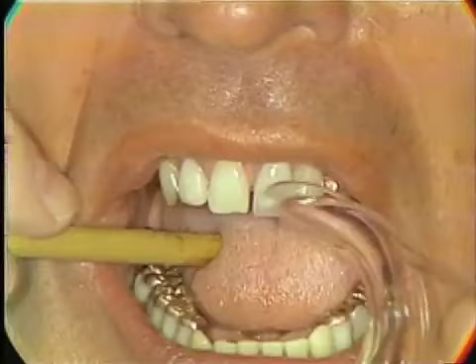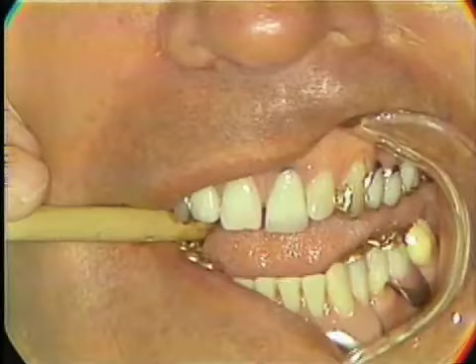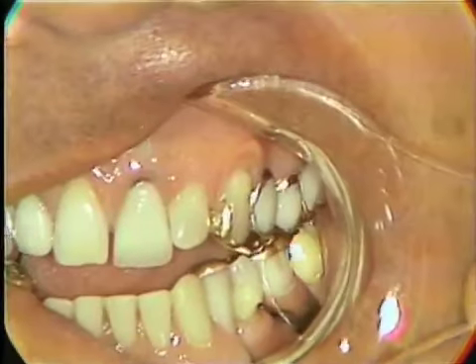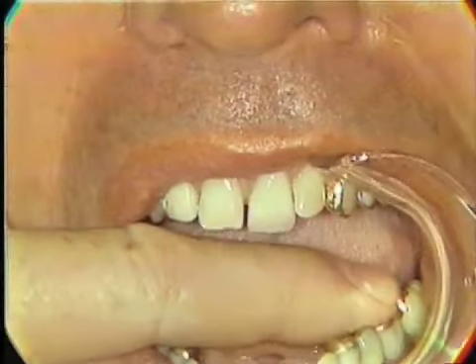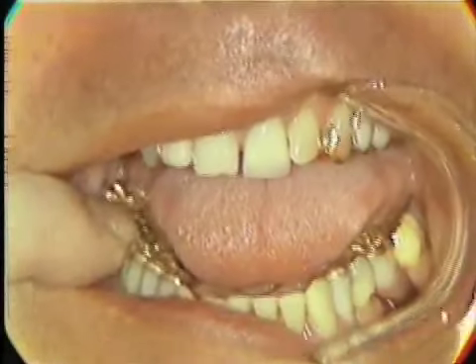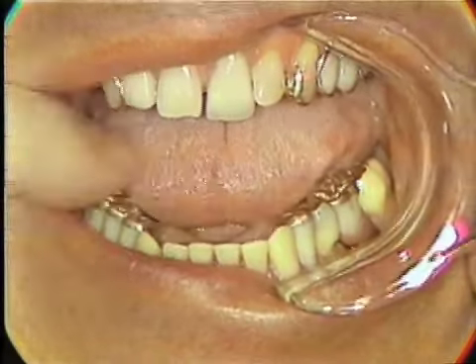Open again, please. Close. Would you bite on that, please? Open. This base should stay against the tissue. If we get movement of the base on this side, then this side should come up.